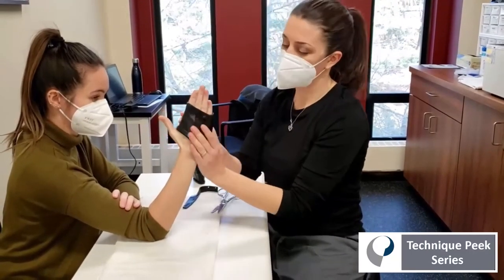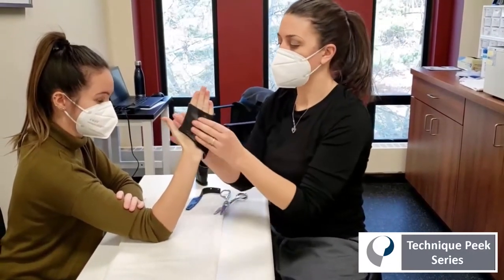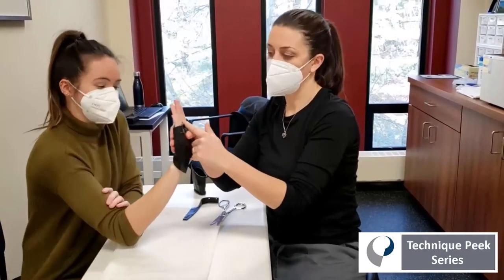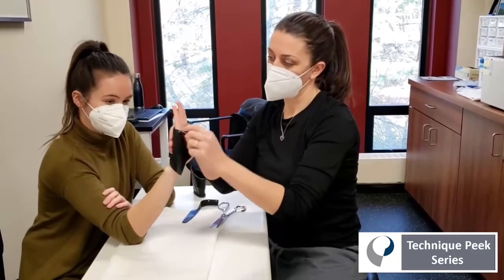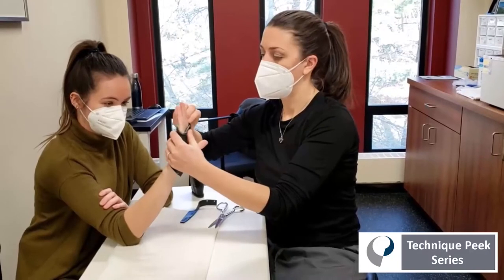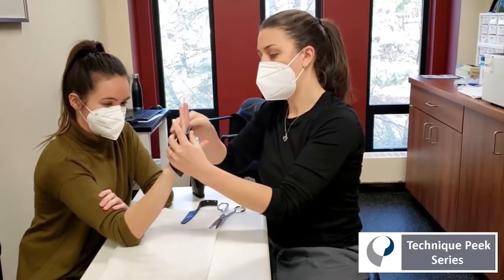Tight is better. In this case it doesn't have to look good. Once it's wrapped around, while it's still warm, you're going to use the opportunity to roll down to clear the IP joints, especially that pinky, all the way around if possible.